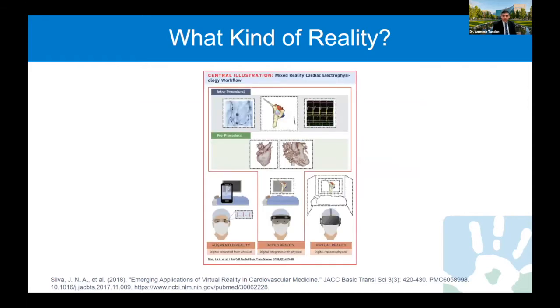And these can be used in different parts of the procedural process. So since VR blocks the view, it's hard to do a procedure with it on, while augmented reality is starting to be used more, and Dr. Agarwal will discuss that more in his talk. So I'll focus mostly on 3D printing and virtual reality.